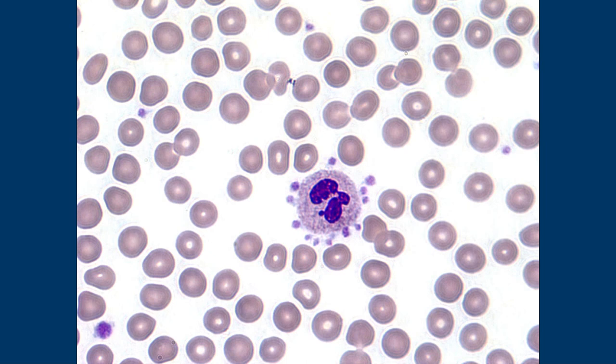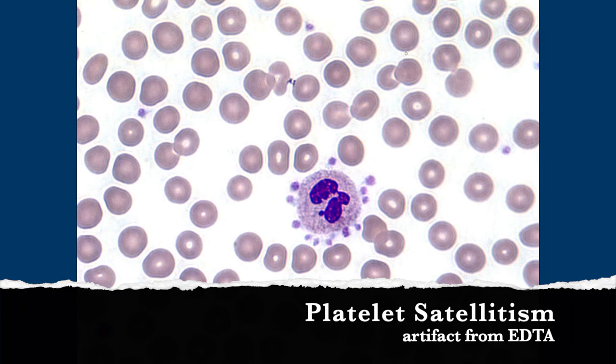Those are platelets sticking to the outside of — I think a neutrophil, right? I remember that picture from studying for boards, but I can't remember now what it means. Are they covered in antibodies or something, like autoimmune? Well, it's platelets — it's also an EDTA artifact. Oh, it's an artifact! I just remember seeing it and thinking it was pretty.